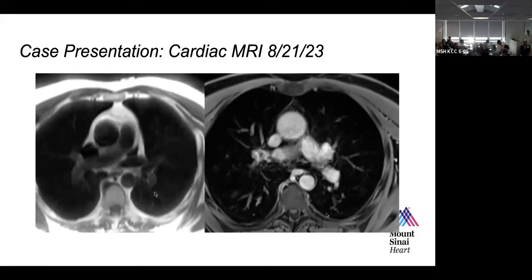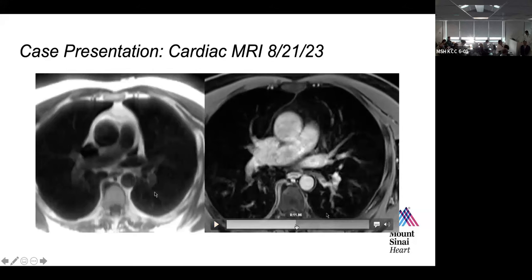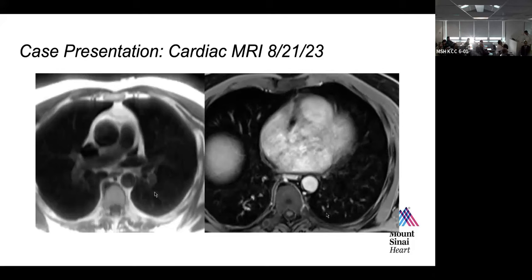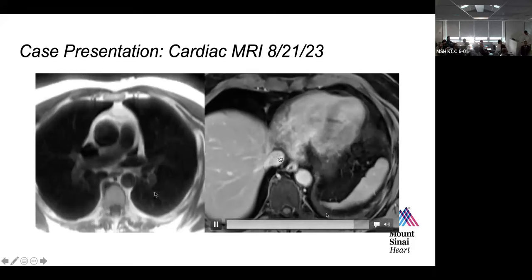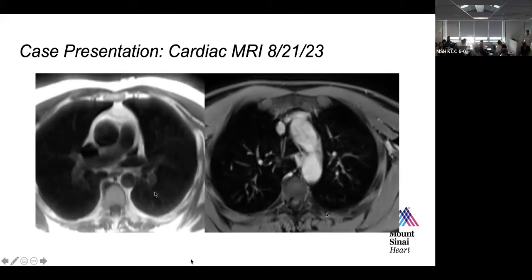I would say when we are looking in general, be it a black blood or even our survey when we first started, or the angiography sequence that's being shown there, we are looking at it systematically, right? Obviously, we kind of know what the diagnosis is, they gave us the case, but when we don't know what the diagnosis is, we follow this systematically. So usually we start from the bottom up, and we make sure that we have levocardia, and we start very basic. We have levocardia, we have the IVC, and if you want to go all the way down we can walk through that, the IVC going into the right atrium. We have the right ventricle. Are we convinced, be it from this view or other views, that this is a right ventricle? And we make sure that what comes out of the right ventricle is the pulmonary artery. And the same thing for the left ventricle.